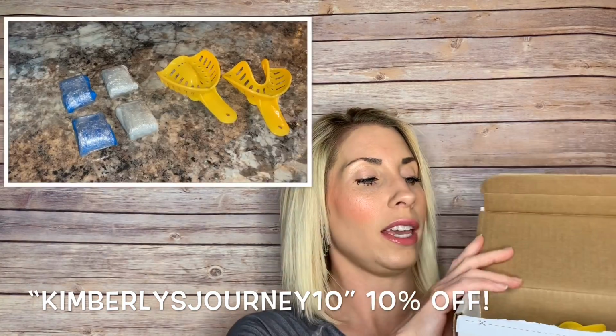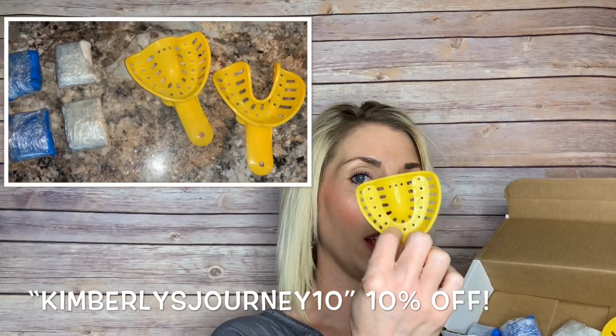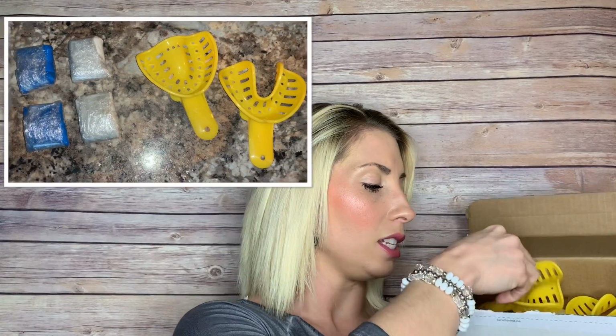Inside your kit, if you get the uppers and the lowers, you're going to receive your trays, your upper and your lower, as well as your putty to mold together and put into the trays so that you can get impressions of your teeth. You get a blue one and a white one, and you will mix those 2 together, and you got to work really, really fast because that mold will harden super quick.